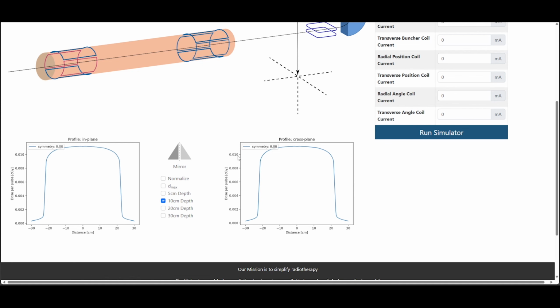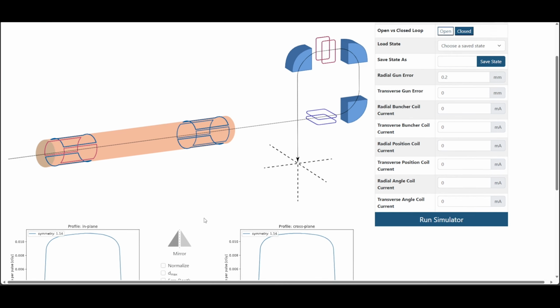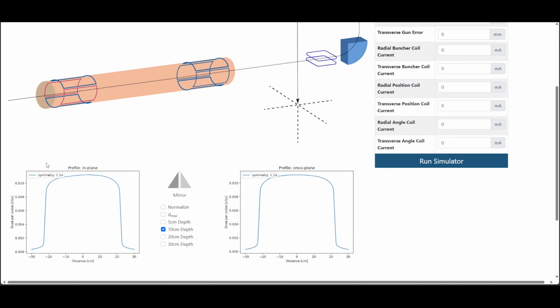Let's see what happens if we have an asymmetric beam that we need to correct. We can introduce asymmetry using the gun error function, and then correct it with the steering adjustment. Let's introduce a 0.2 mm gun misalignment in the radial direction. As you can see, the in-plane profiles on the left have changed and became asymmetric. The change might be subtle and difficult to notice.